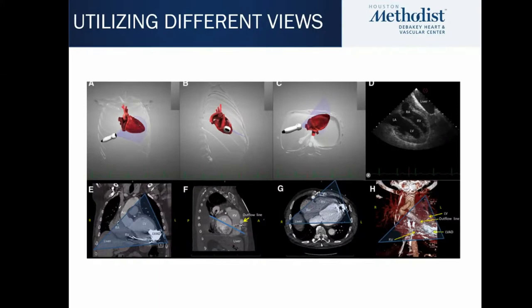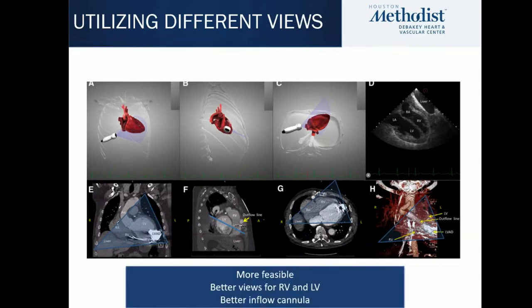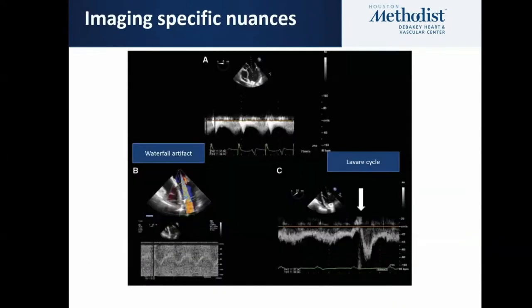or sonographer to capture better images. But there have been some newer studies where utilizing different views for capturing better image quality in patients who have LVAD. And one of those views is basically the transhepatic view, where they were able to capture the RV and LV better, and was more feasible, and they were able to actually angulate better with the inflow cannula. So there is room for improving and utilizing different views in these LVADs.